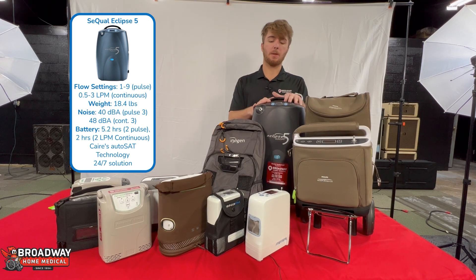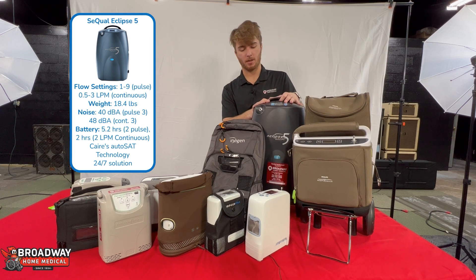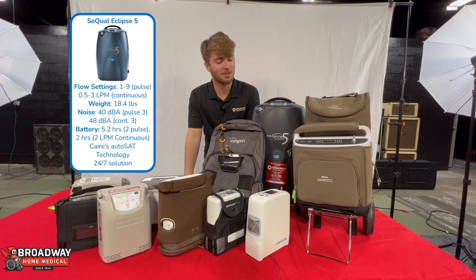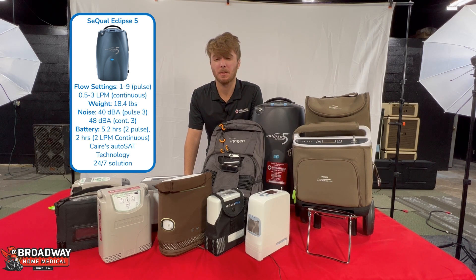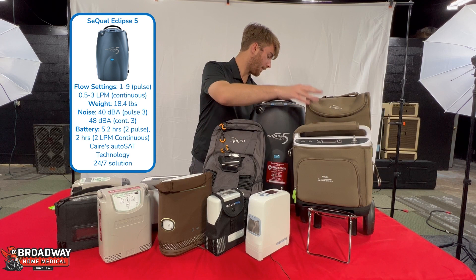Speaking of which, the Eclipse 5 is the big mama of portable oxygen concentrators. It is about the size of a lot of home concentrators. The big thing is that it has a battery and a lot of options for settings — it goes up to a nine pulse dose, which is kind of crazy, and it has a higher continuous dose setting than any other of these machines.